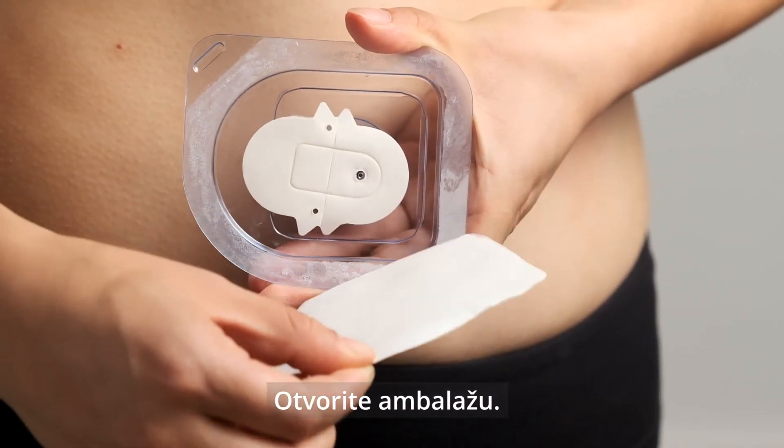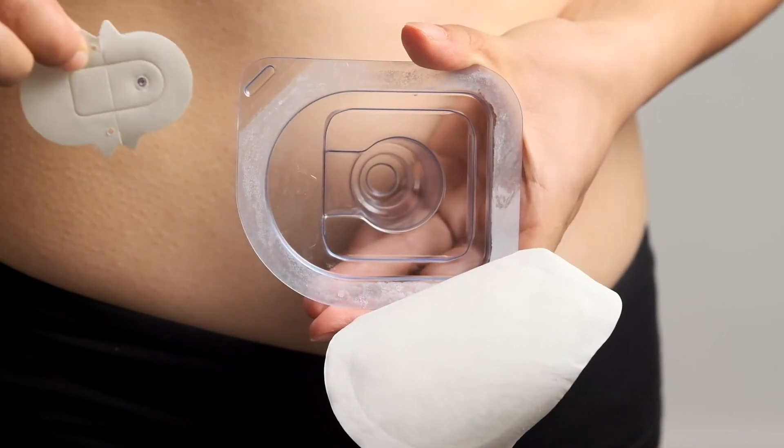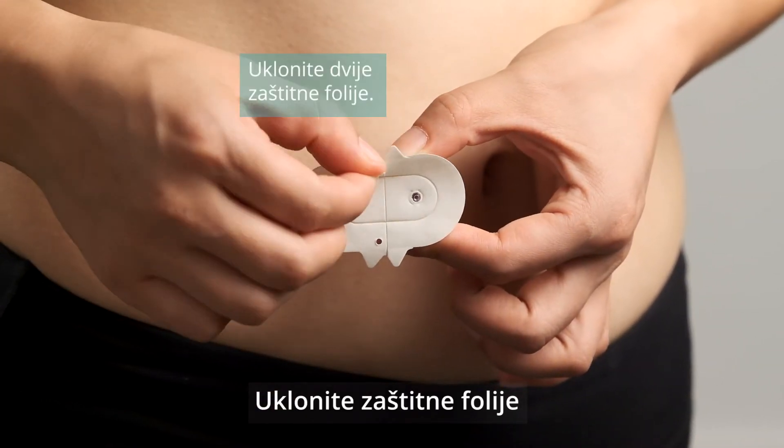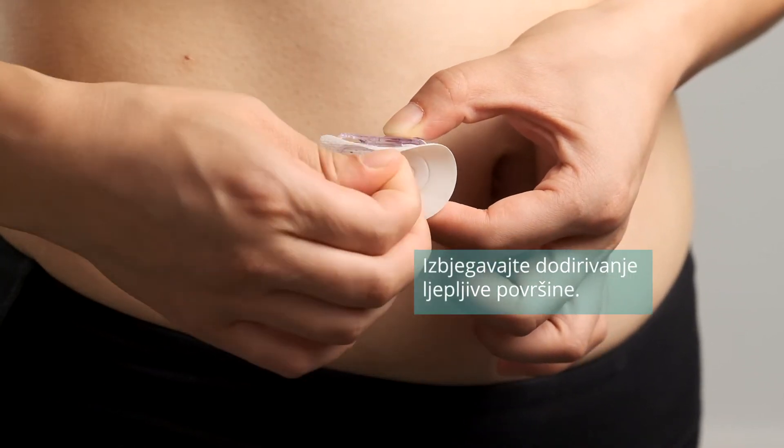Open the sensor package. Gently take out the sensor. Remove the two pieces of protective liners. Avoid touching the adhesive area.